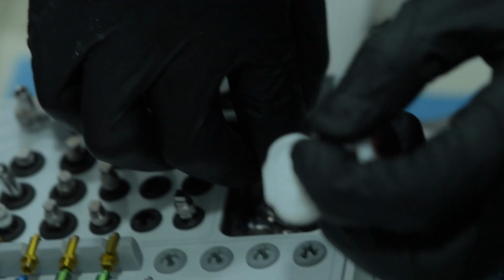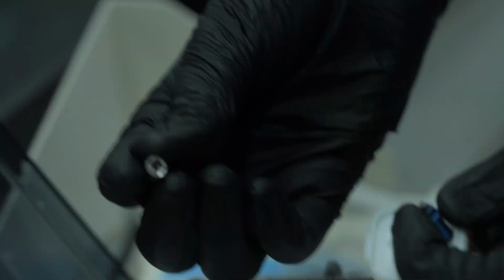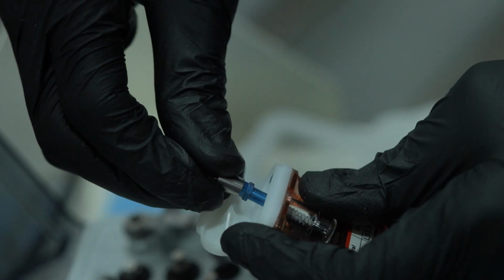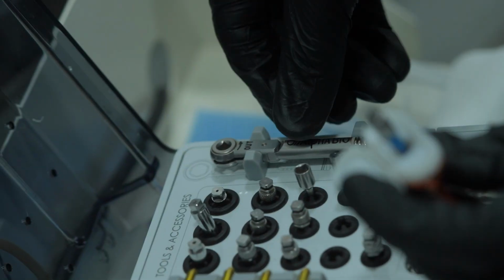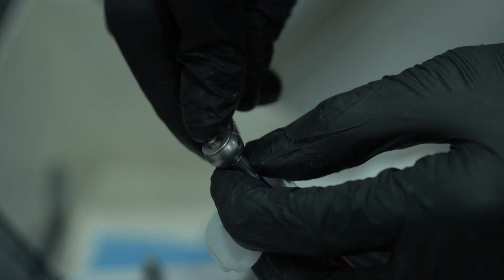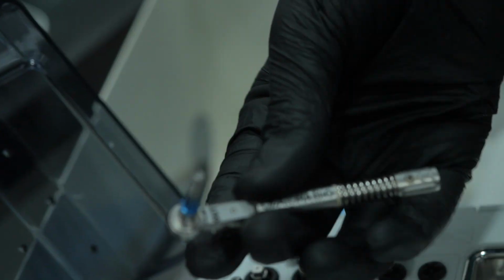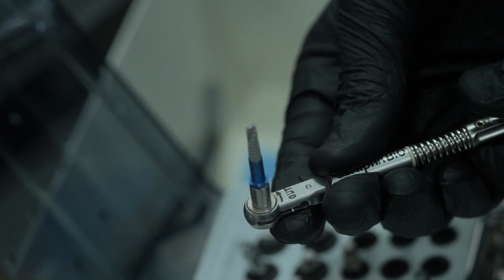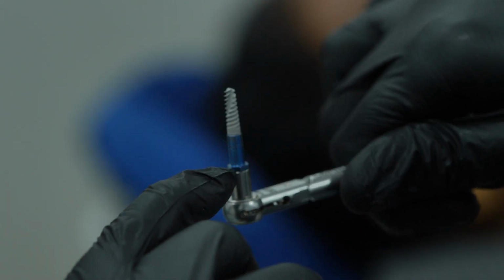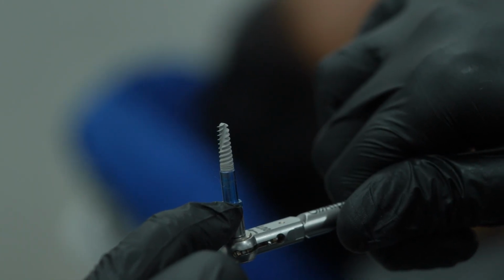Okay. Once done, then there will be an adapter. Okay, now with a hand ratchet we will just tighten it. This is how it is completely the assembly. We are supposed to make sure that this border goes and flush with the guide.